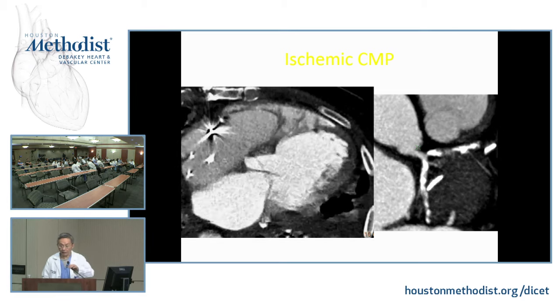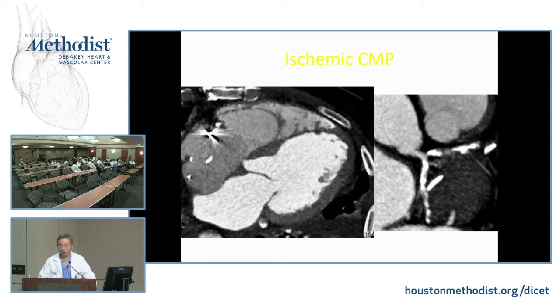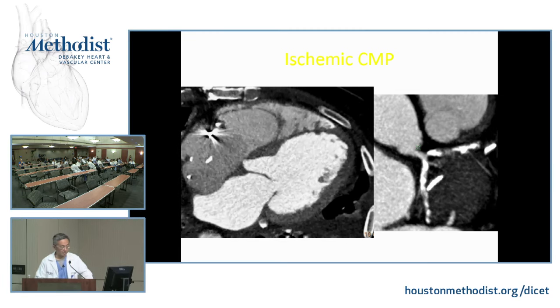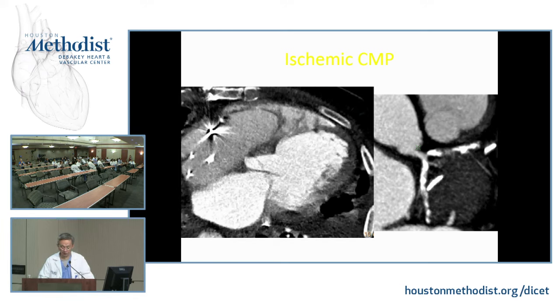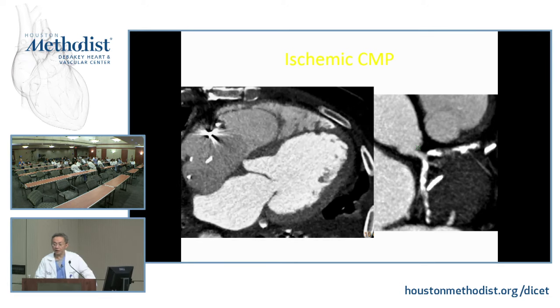I agree completely. For diffuse dense calcifications, I think perfusion studies. But in terms of whether the patient has stenosis, depending on the clinical question, it's hard in practice. You get a referral from a doctor to do a test, and unless it's completely contraindicated for safety reasons, it's hard to send the patient out.